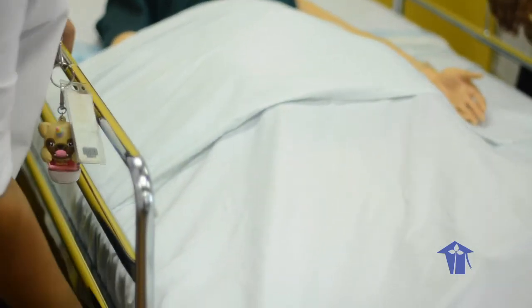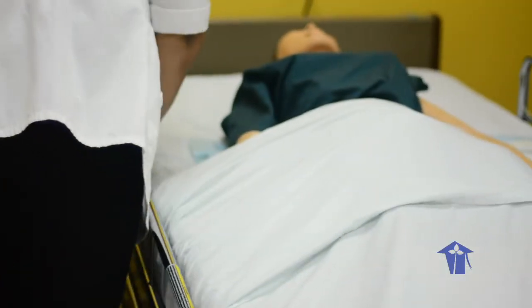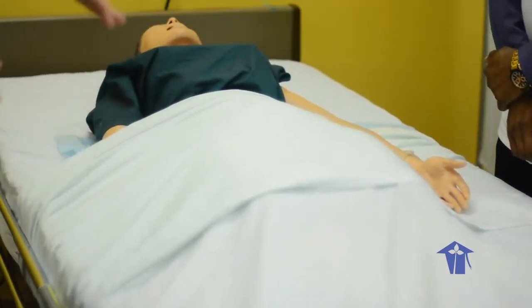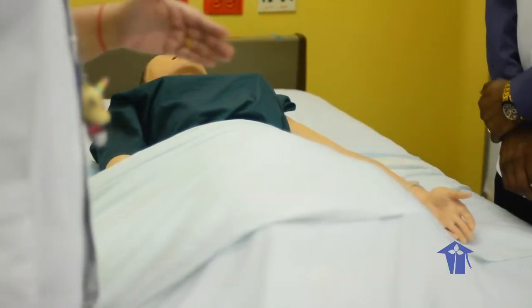First, you will obviously put your side rails down. We're going to raise the bed. What you do, you raise the bed to your shortest person, all right? So I think Mr. Karim is a little bit shorter than me.